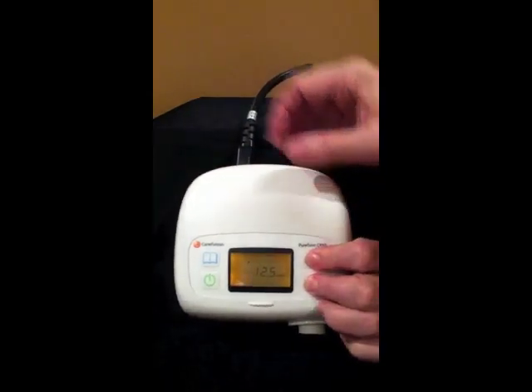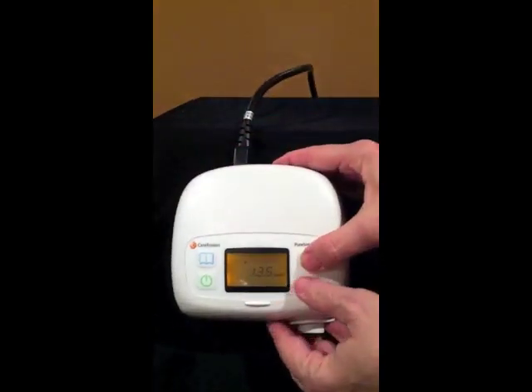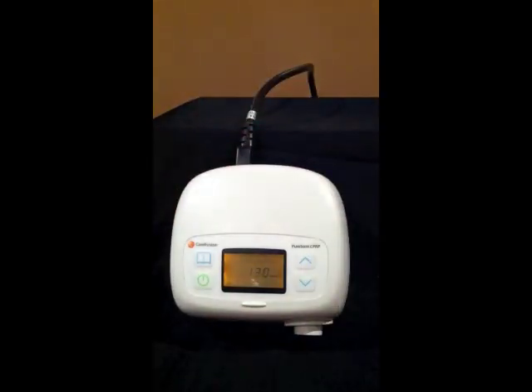While holding the up and down buttons and depressing the menu button one time, you can adjust the therapeutic pressure up or down. Lock that in, turn on your machine, and you've just set your CPAP.